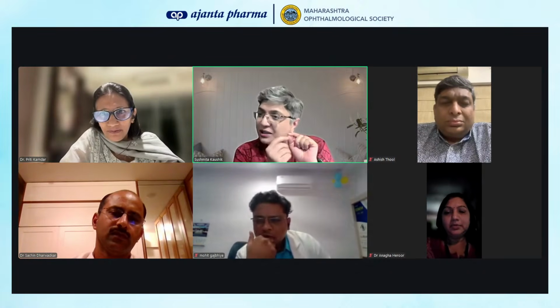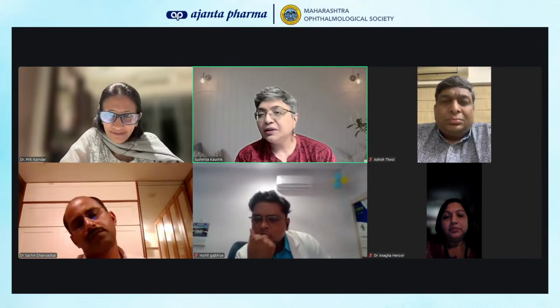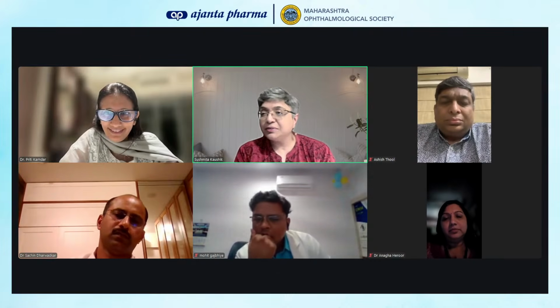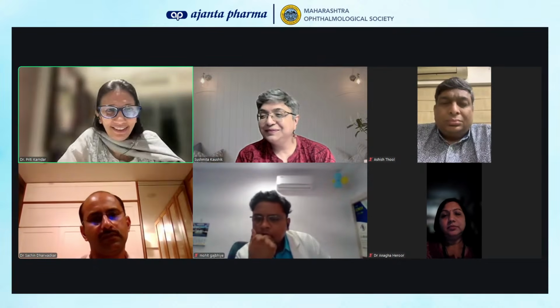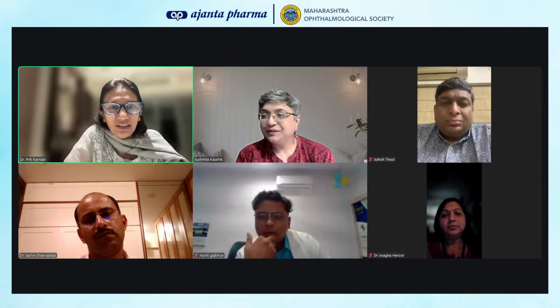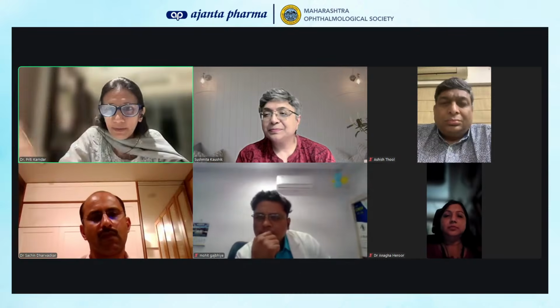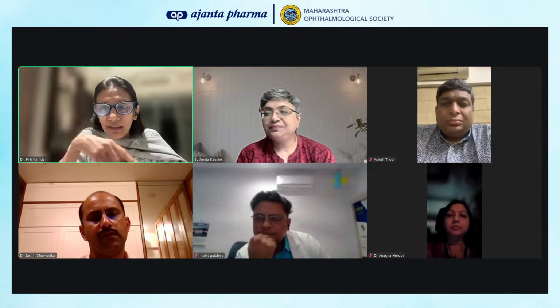That locus ka 30% goes before that point is this thing. So it's something to really keep in mind, this 30% business. So what Dr. Sushmita is saying very clearly is that yes, we can only say that RNFL loss occurs before perimetric damage, but you don't have to panic ki 30% gaya, because that sort of reflects into 50% tumhara nazar gaya.